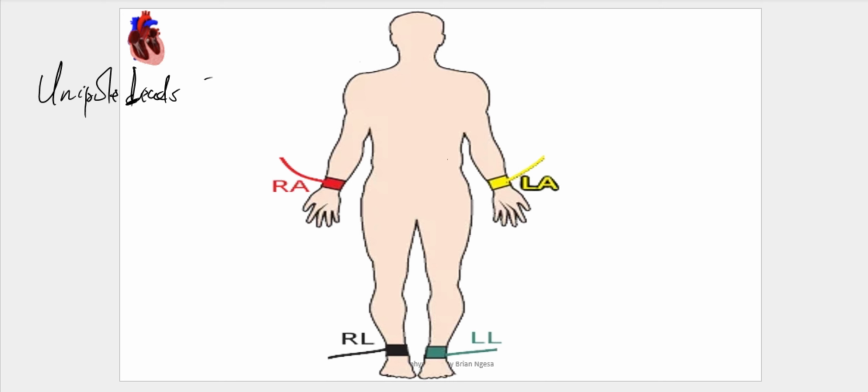So we say that these have 1 electrode. This can again be identified as Wilson central terminals. As the word suggests, or the abbreviations, they normally tell us a lot of information in regard to the ventricles. So this can be from V1, V2, all the way to V6. So how are they placed? Let's start with V1. Where do you place your V1?